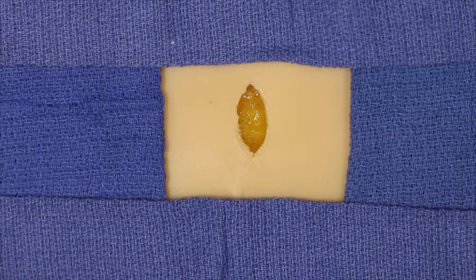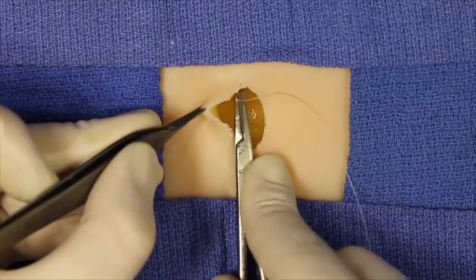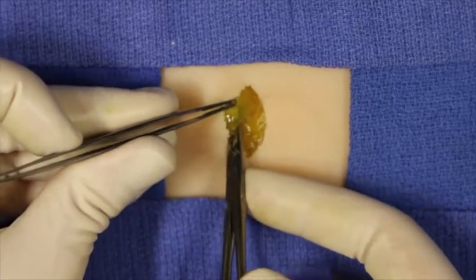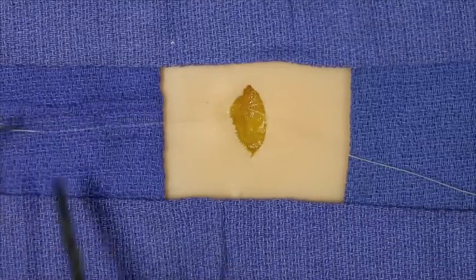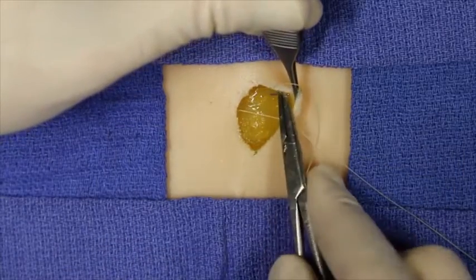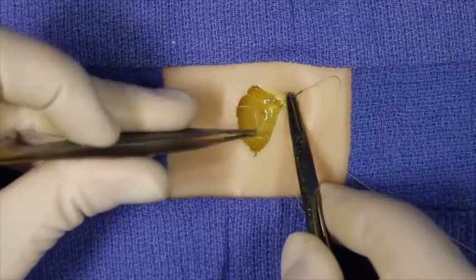The fascial placation suture is performed by taking a bite of fascia on one edge of the wound, reloading the needle, and then taking another bite of fascia on the contralateral side of the wound.